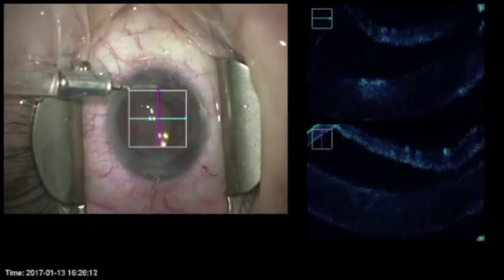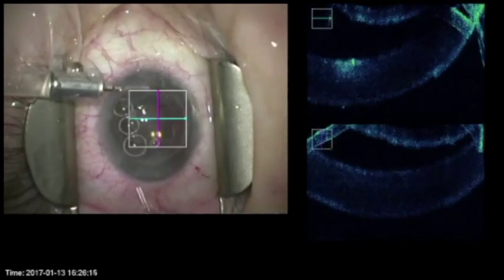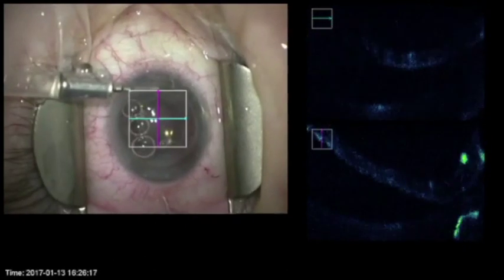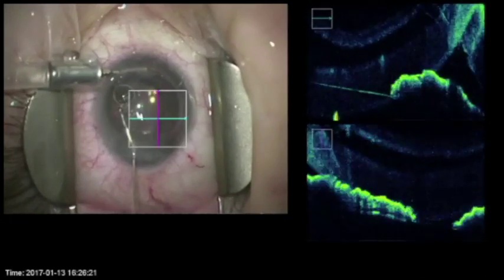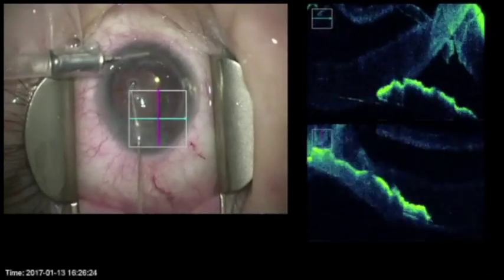And air will be instilled. First, I inadvertently place some in the interface, which will be removed.